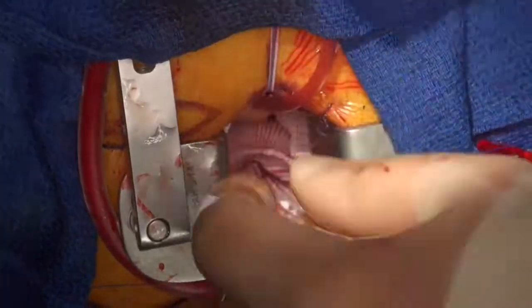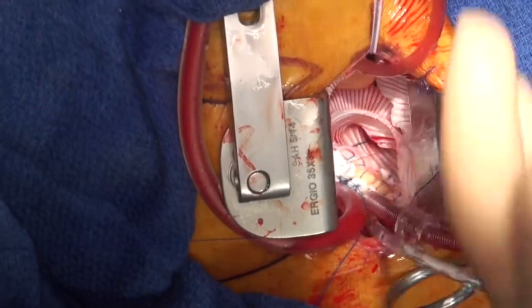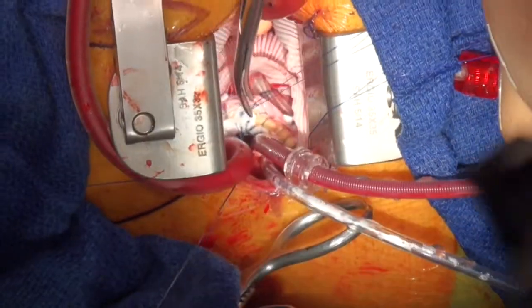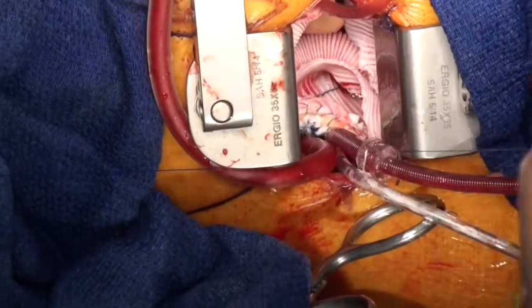It should be noted that even though this is a mini-sternotomy with a very small incision, you actually get perfect vision throughout. Tristan obviously has even better vision, but even next to him we're getting a great view from a camera above the table.